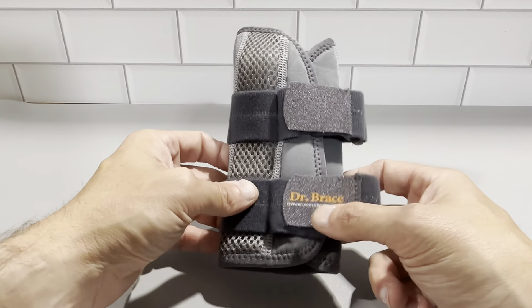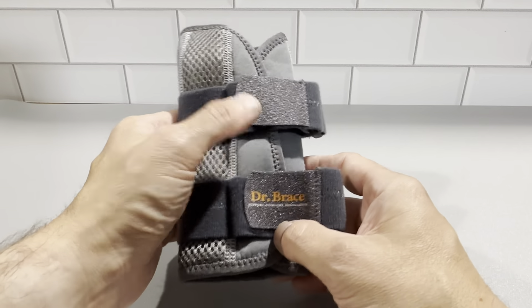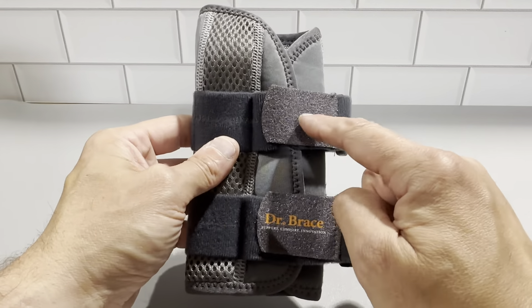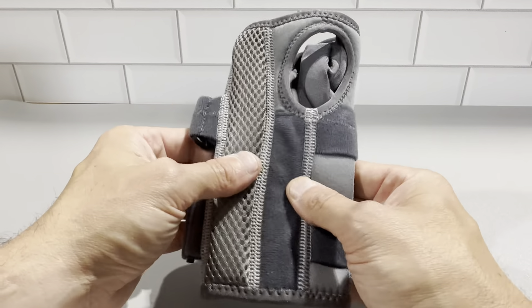This is the Dr. Brace wrist brace for carpal tunnel. This is a really nice product. Dr. Brace is a really great brand — they make some really good stuff. This one here is gray in color and this is the small to medium size. This is a really nice brace.